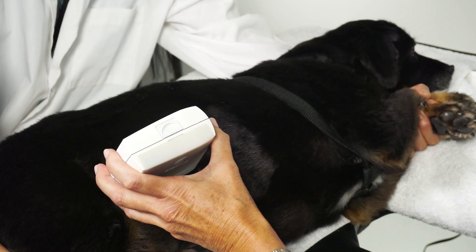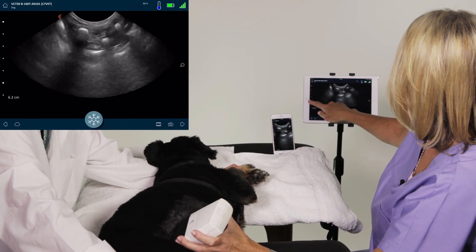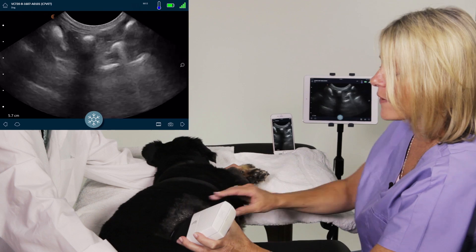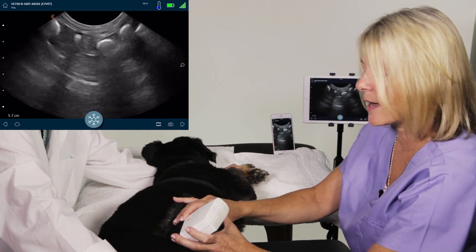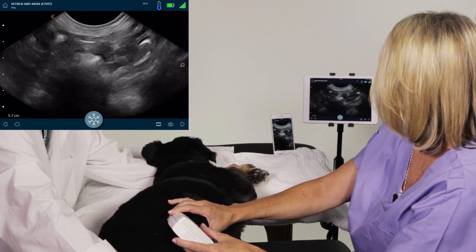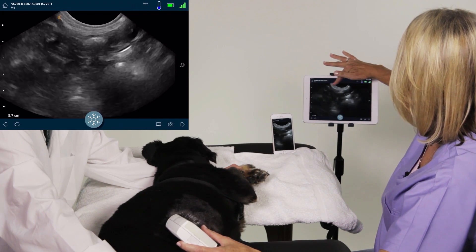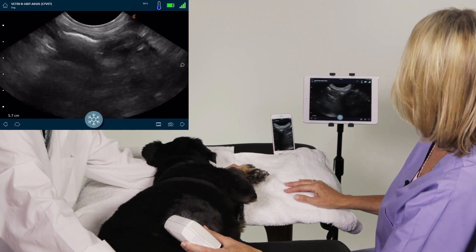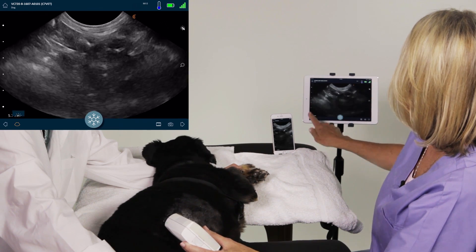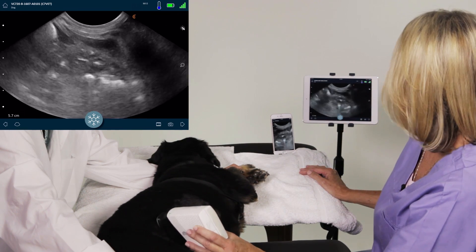The Clarius itself is very easy to use. The applications are pretty well set up. We can just apply our finger to the screen and we change the depth to what we wanted. If we find that we turned the wrong way — let's say I do a transverse and I realize part way through that I should be in the other direction — rather than lose my picture, I can actually turn the view around very easily. We also have an auto gain feature, which adjusts the gain from top to bottom, left to right, making it very easy to use as well.